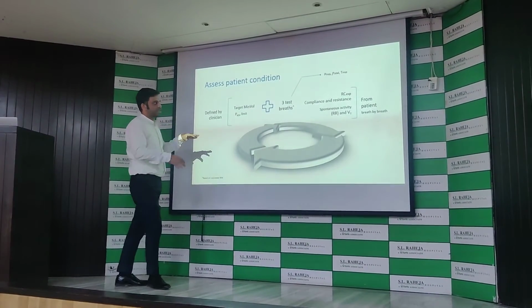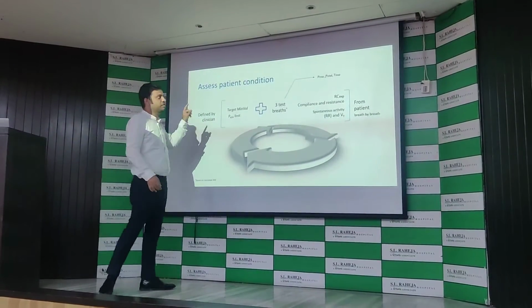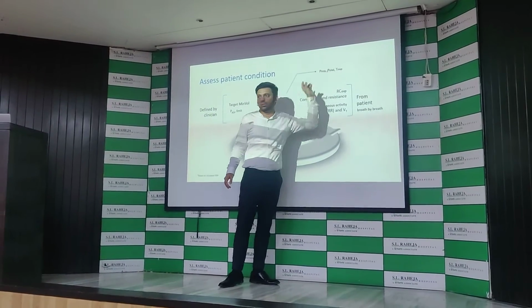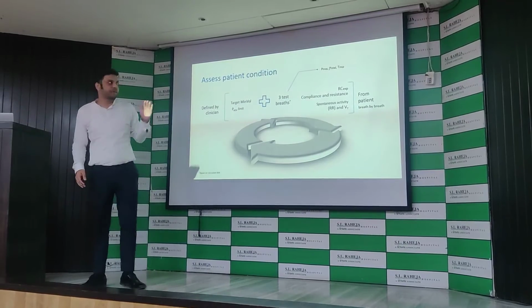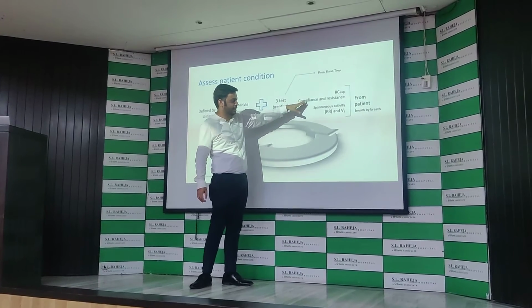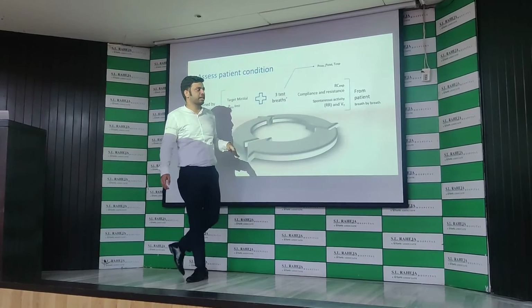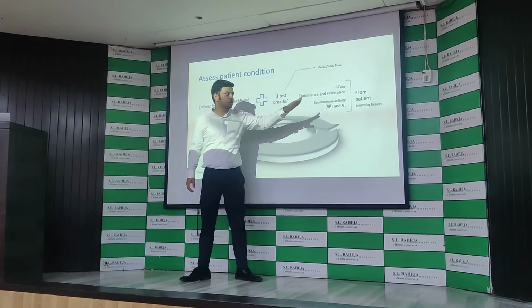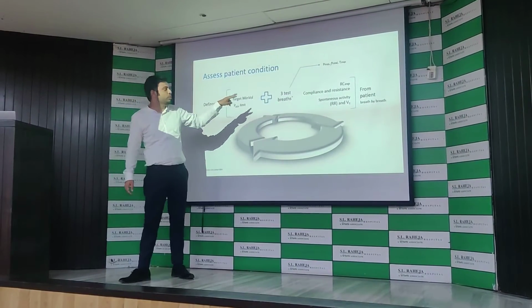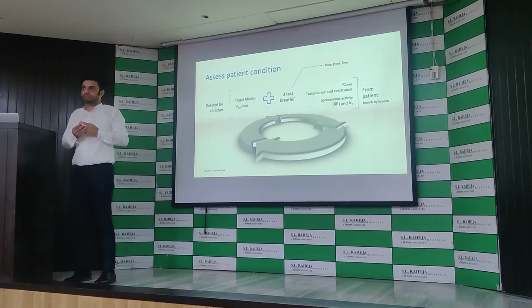Now, when we attach to the patient, it first gives 3 test breaths, and with those 3 test breaths, it achieves the best inspiratory pressure, the RR and the TI, inspiratory time. Based on that, it will calculate the respiratory time constant with the compliance and resistance. It will also measure the patient's spontaneous activity by the RR and the volume, breath by breath. As I said, when we attach, it is going to give 3 test breaths to achieve the best possible values. So this is a knowledge-based system.